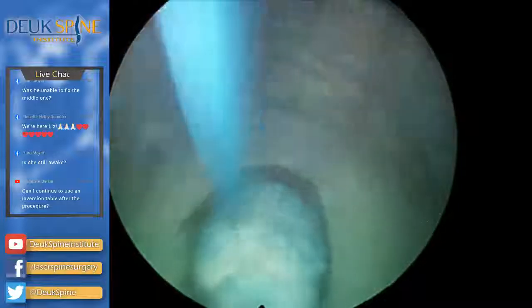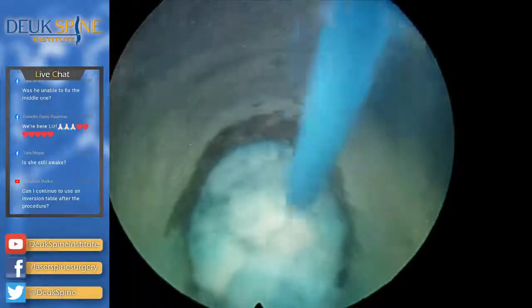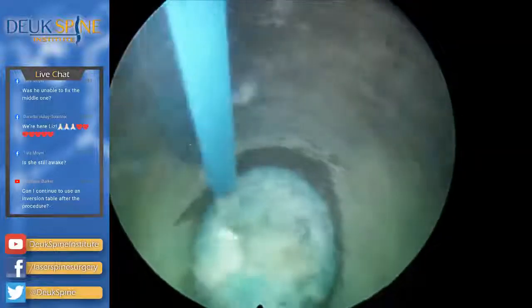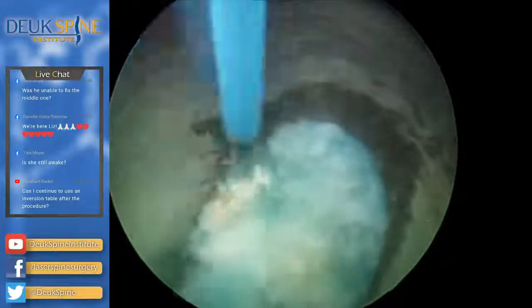That may be what more recently happened for this patient, because when I look at this, the deep part of it is a relatively new injury, on the order of months rather than years.